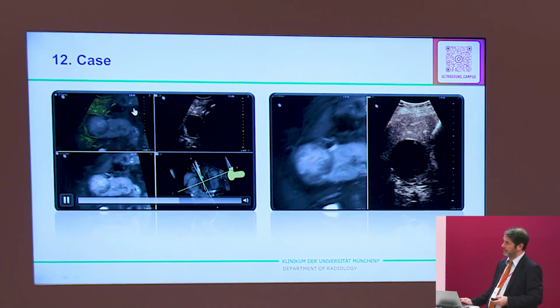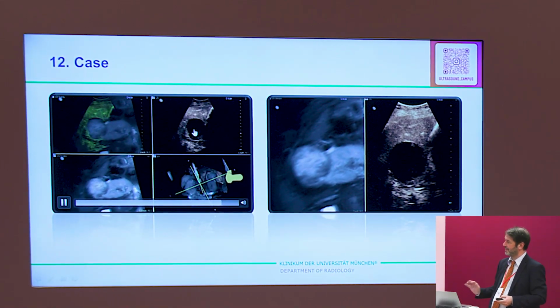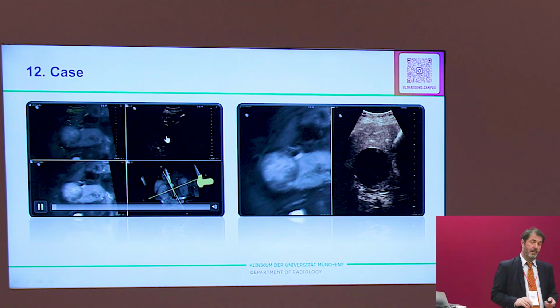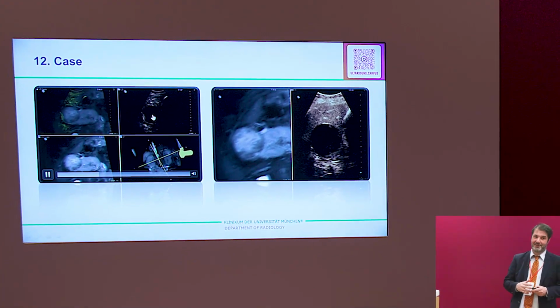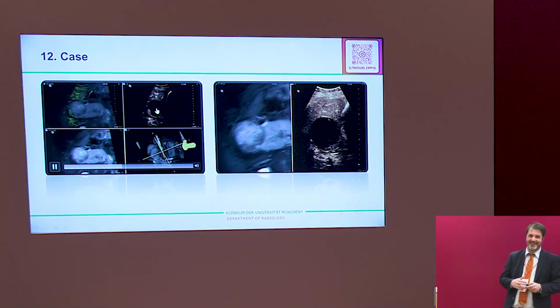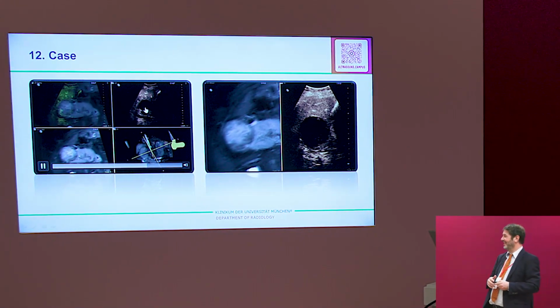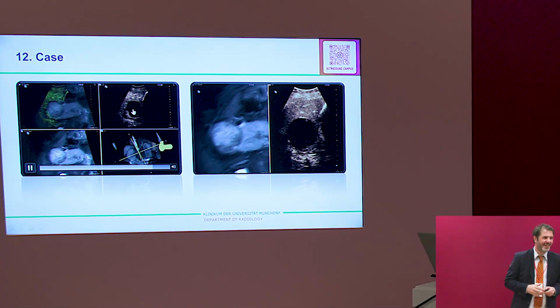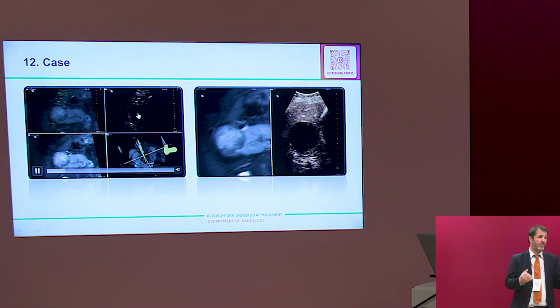There's our MRI lesion. There's our ultrasound lesion. What is it? What would be your best diagnosis? Alive or not alive? Alive. Not, it's black. So not. Vincent, you have to help. You said alive. Alive, that means blood uptake or not blood uptake?